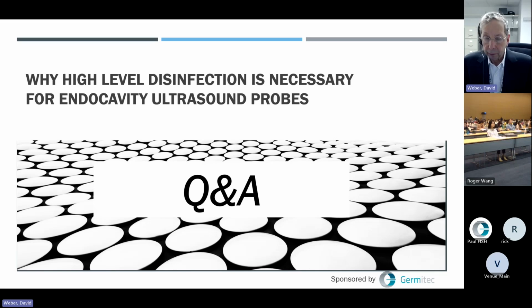While, similar to chemicals, certain organisms are more resistant, such as spore formers and non-envelope viruses, at a microbicidal wavelength of UVC you get very rapid destruction of DNA, RNA, and protein coats, inactivating the organism.